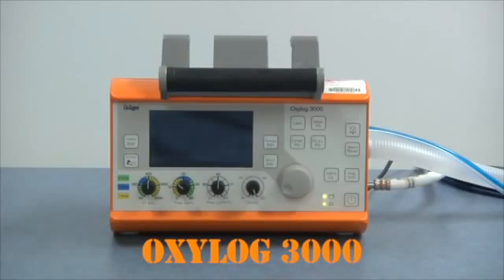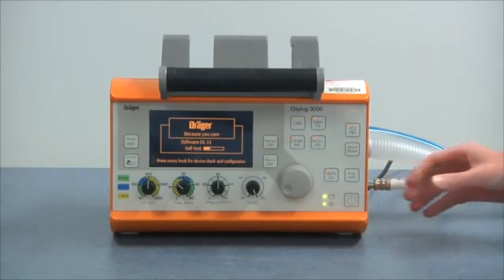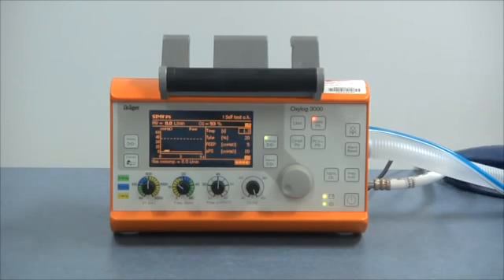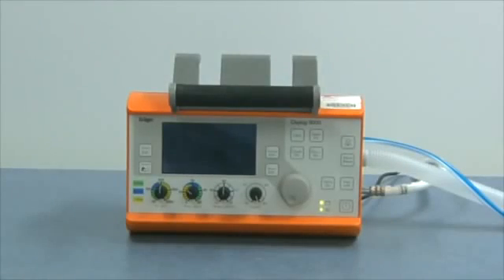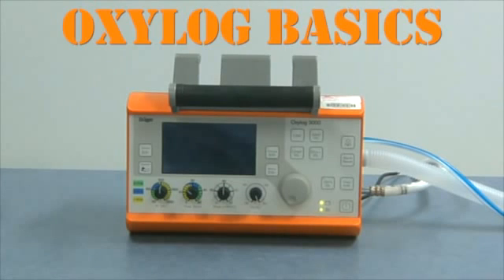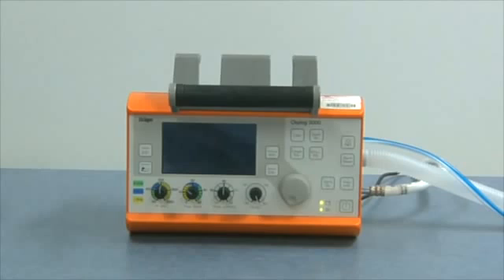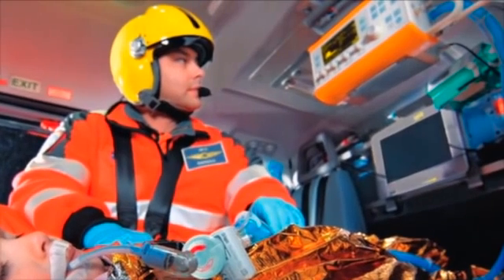This is the Draga Oxilog 3000 Ventilator. It's specifically designed for emergency department and transport team use. It's recently been superseded by the closely similar Oxilog 3000+, but for the time being the 3000 is more common. This tutorial is about Oxilog basics: the parts of the machine, connecting it, and setting basic ventilation parameters. By the end of the tutorial you should know how to use an Oxilog to keep a paralysed patient alive.